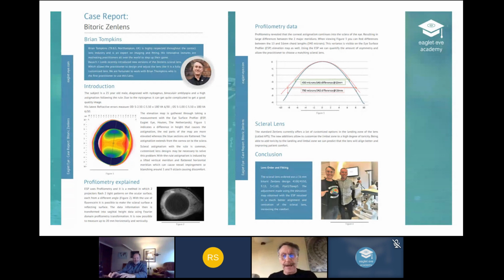But from the point of view of the Eaglet Eye, so Arno, this weird, strange Dutchman, turned up to me about 6, 7, 8 years ago. I don't know, Arno, you can tell me how long ago, and said, look, I've got this device that measures slightly wider out than the cornea, and would it be of any use? So I thought, well, yeah. We were starting to build with toric lenses, with scleral lenses around that time. And so I had a look at it, and he brought this device out of his car that was stuck together almost with glue and cardboard. And I've watched and followed through everything as we've gone on.